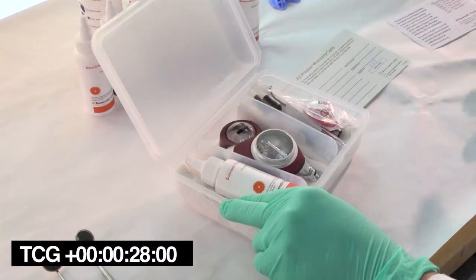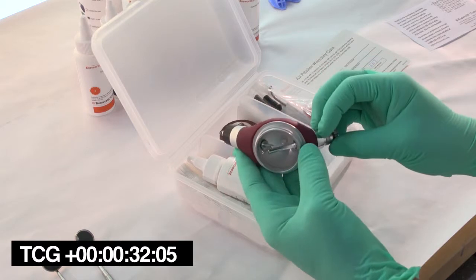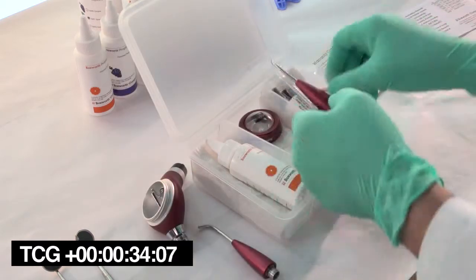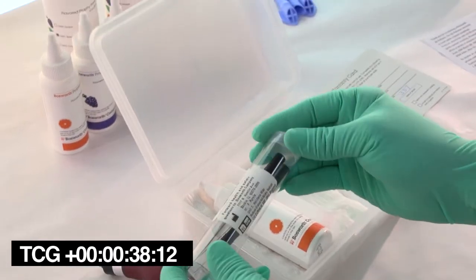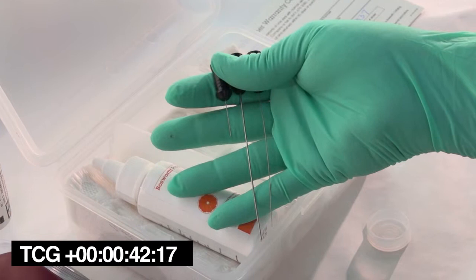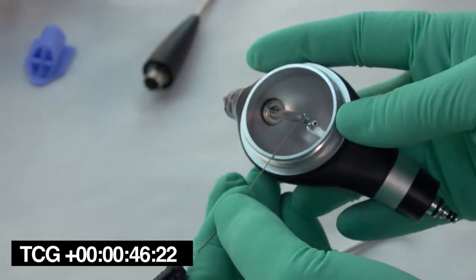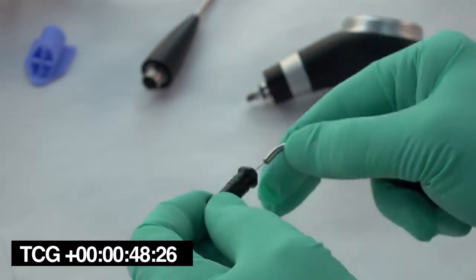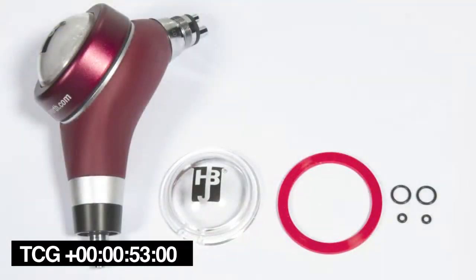Review the contents of the air polisher package. Enclosed, you'll find the air polisher body, 2 autoclavable nozzles, and a cleaning kit. The cleaning kit contains 3 different cleaning wires: 2.5 centimeters, 8 centimeters, and 10 centimeters. These sizes are to assist you in cleaning all the various air and water passageways inside the tips and the air polisher body. Additionally, there are various gaskets and a replacement cover for the powder reservoir.